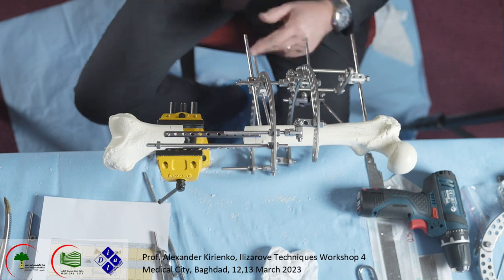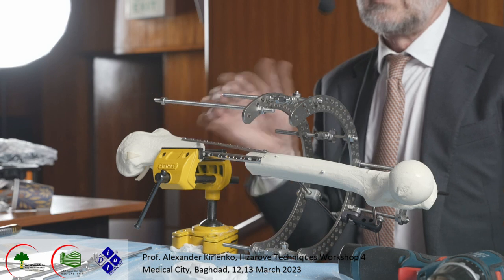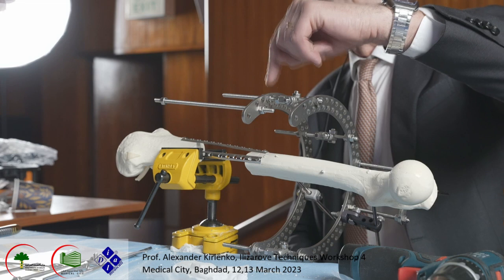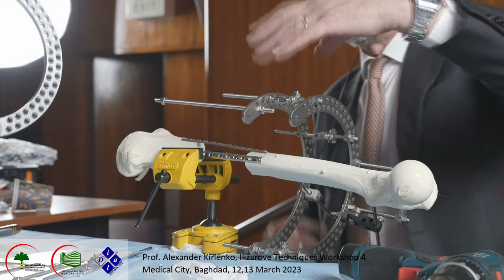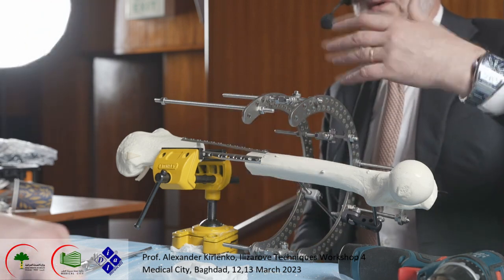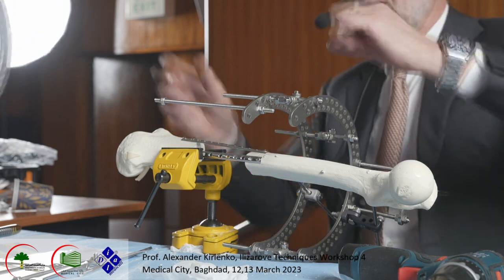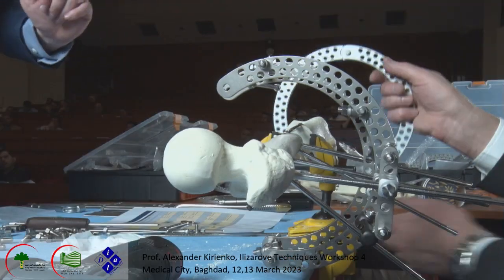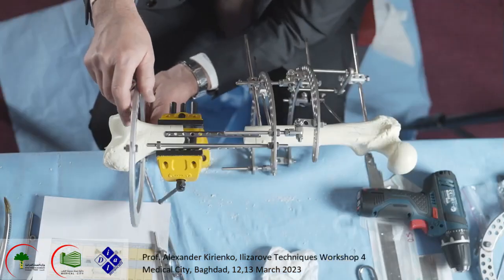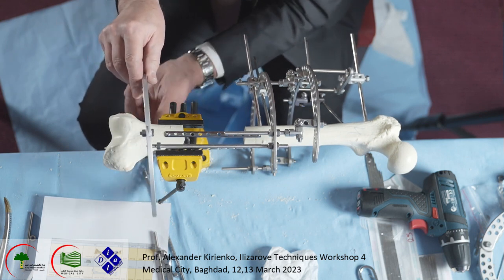Okay. In this case, we use the same ring. Maybe in your operating room, you have different sizes of rings. Probably the intermediate one, the 5 or 8, should be a little bit bigger. This bone doesn't have muscles. We don't know how it is, but a real patient has a big amount of muscles, and here you should put a little bit bigger. In distal, maybe it will be a little bit shorter. Okay, we do the cleaning, we close the wound, and we position the ring.